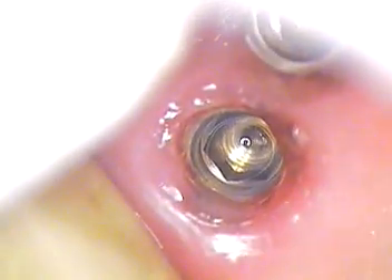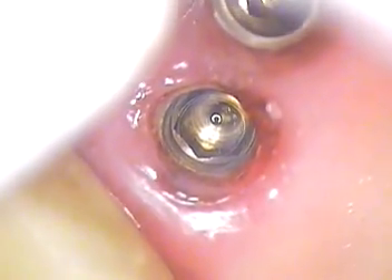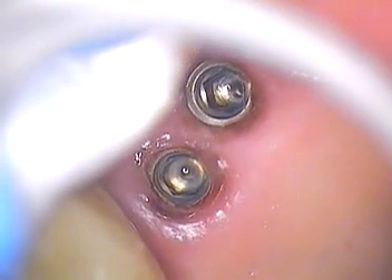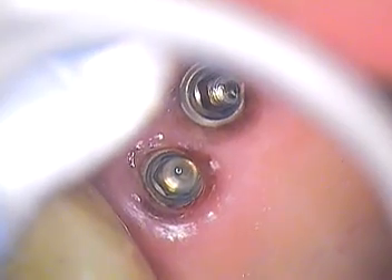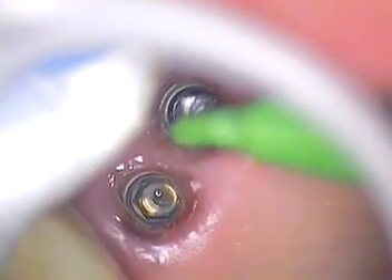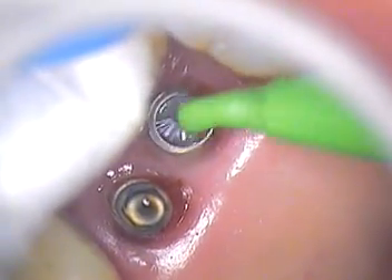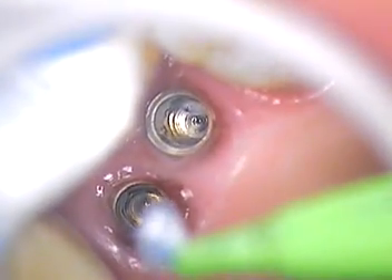Okay, so far so good. You can see the distal one turning a little amber right now. See some of the particles coming up around the hex. They look real close — see how that's still dissolving. They're dissolving. Okay, great. So we go back and we'll scrub again to get all particles out of there. I got to a little different angle and I can actually drop all the way in. That's clean.